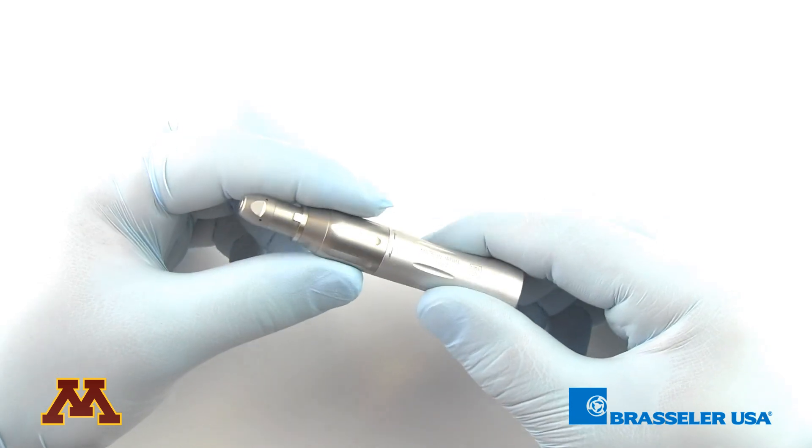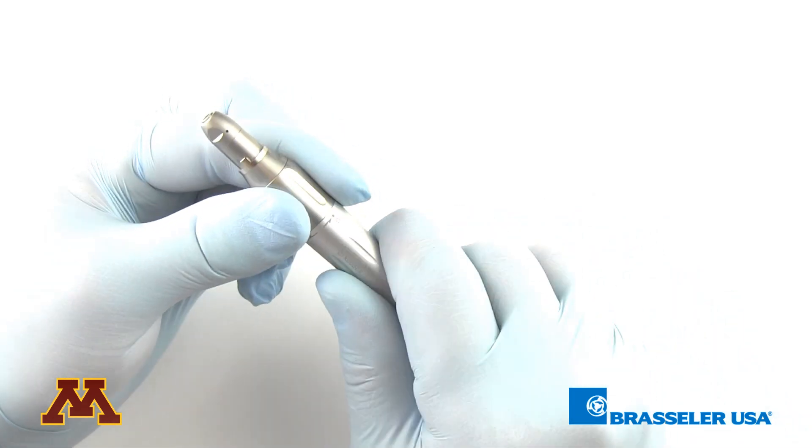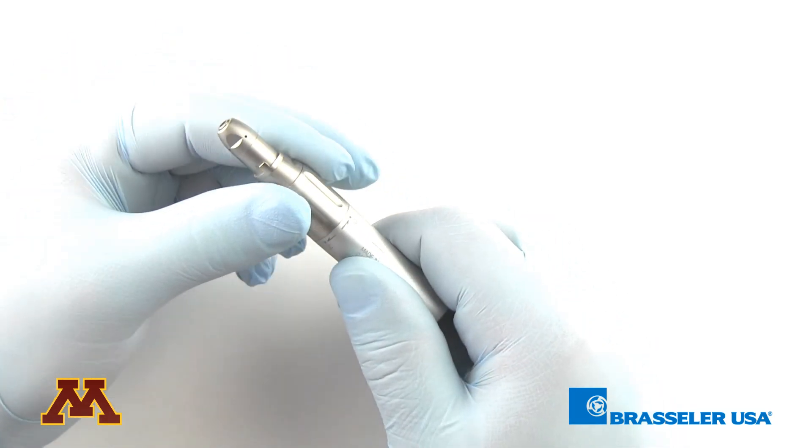With the straight nose cone attachment, it's very simple to open and close the chuck by twisting. You open it to seat the bur and close it to lock into place.